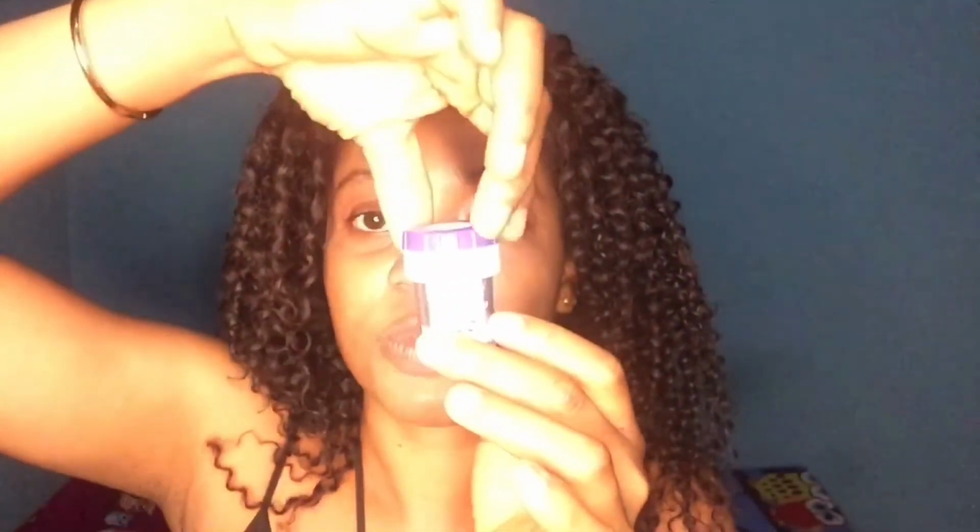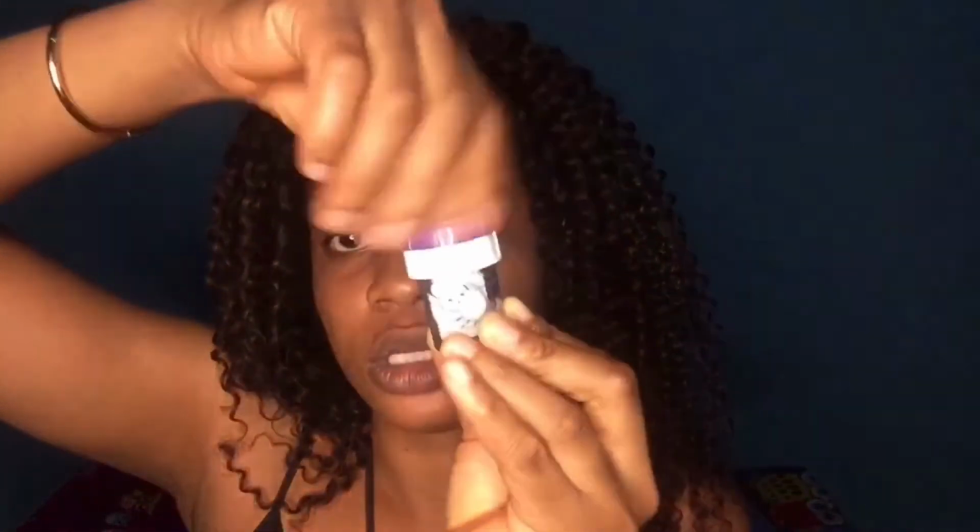Now after closing it, you spin it right on the purple cup. You just spin it like that, and it's going to start fuming inside. Please, before you put your already washed contact lens into this case, make sure you rinse it with your contact lens solution first. So I'm going to put a reasonable amount of the solution into this case. I bring it out. I wish you could see this clearly to see that it is very neat. You can see that you've removed all the dirt.